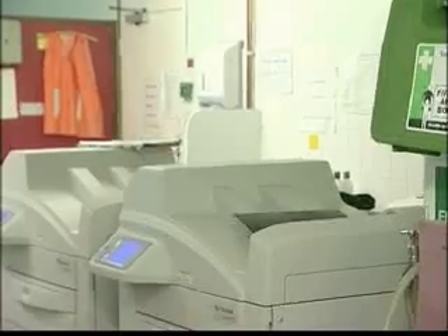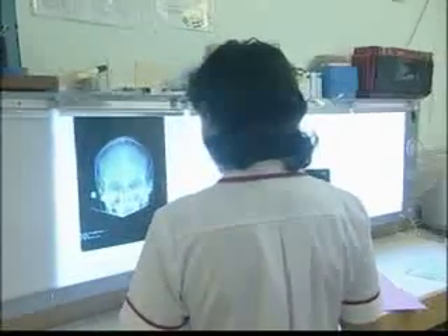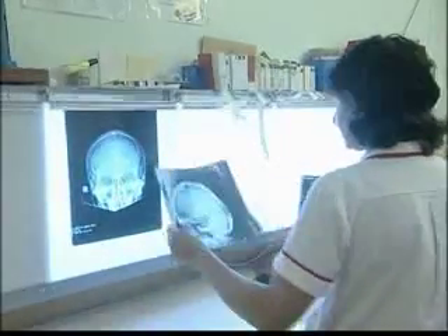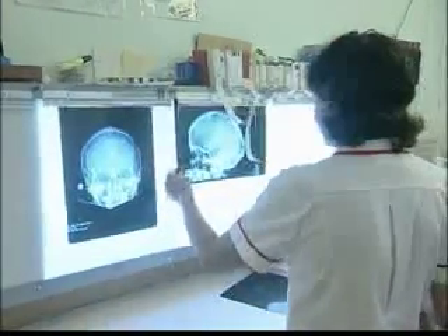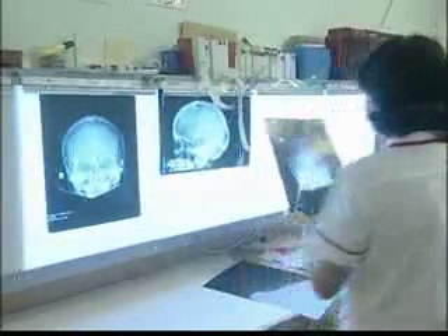It can also print out an image for the radiologist to examine. In this case, the image shows a fracture to the skull. But the doctor is concerned that there could be damage also to the top of the spine — something that won't show up in a planar X-ray. As a result, the doctor will send this patient for a CT scan.